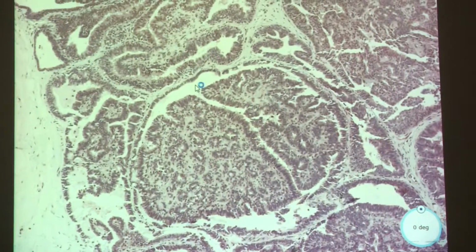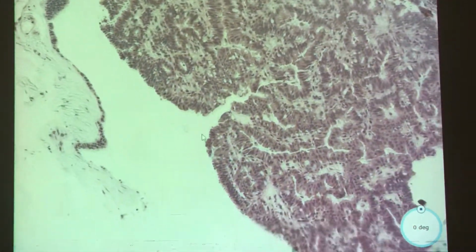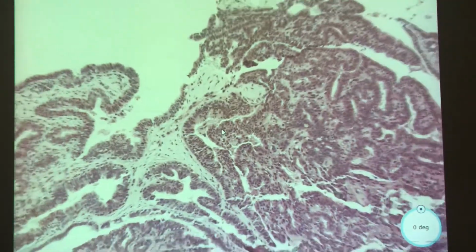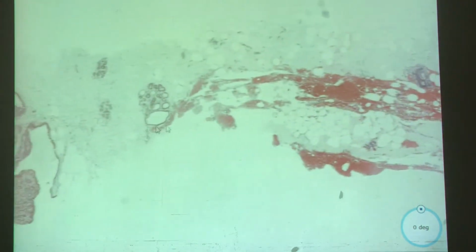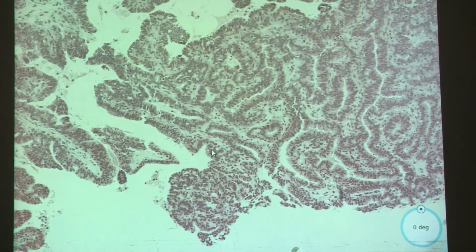Fatty tissue. Yeah. And then we're going to take a look at this real quick, just to make sure there's nothing hiding here, which is always a good practice to incorporate. Definitely. Just a quick scan, go on low power just to cheat a little. But yeah, it looks pretty much the same as the previous lesion. And so I would say this one's probably an intraductal papilloma. Okay. Yeah. And we're going to see here, it's more of the same thing. More of the same, yeah. Okay, so you're happy with that? This is a papilloma? Final answer, I guess.